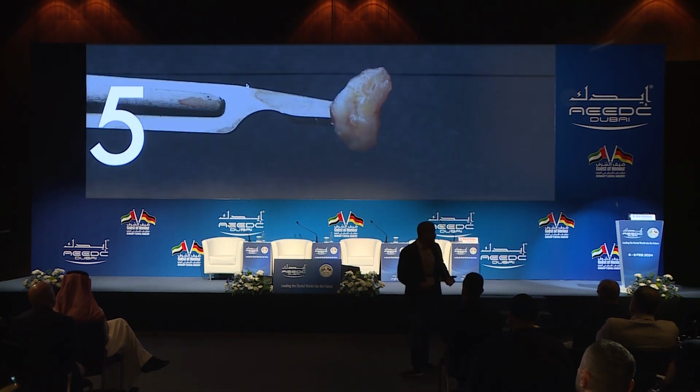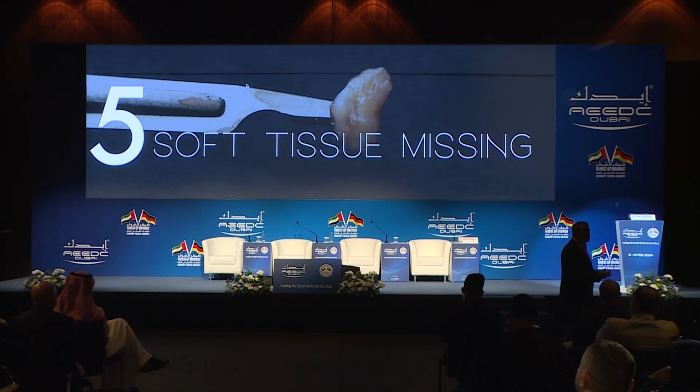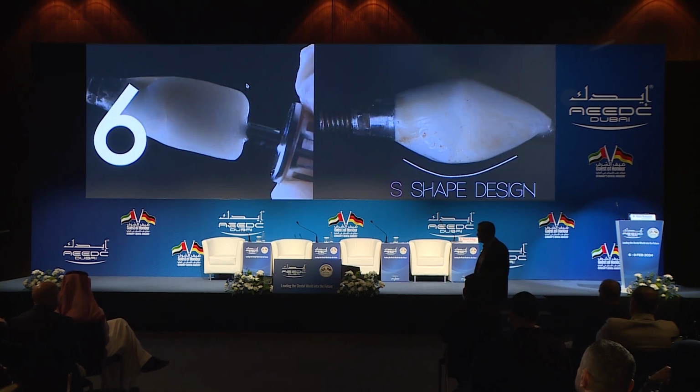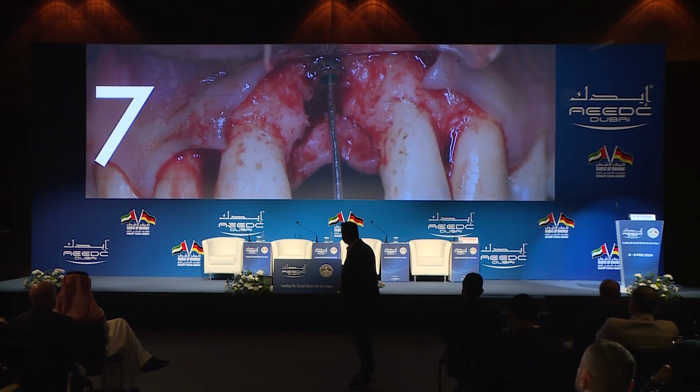And if you don't have soft tissue, go to Brazil to Ricardo. He's the king of soft tissue, right? And then you can always graft the soft tissue, enhance the quality and the quantity, so you can have better aesthetics. Always temporary, and this one will send to Spain, to Ramon, my friend Ramon, to do the perfect ideal prosthetic contour in order to support the prosthesis.